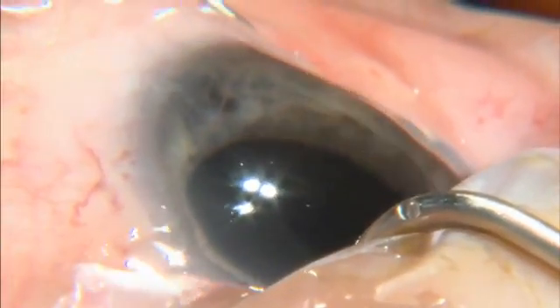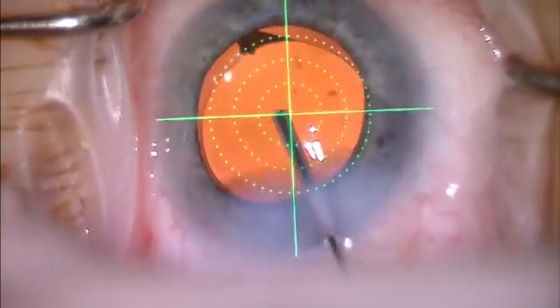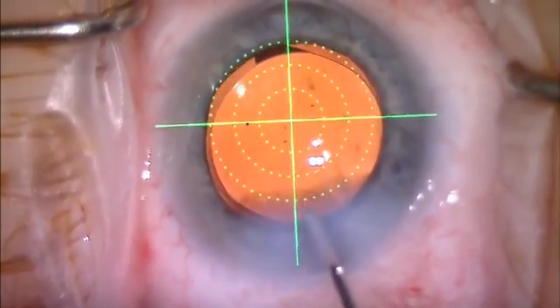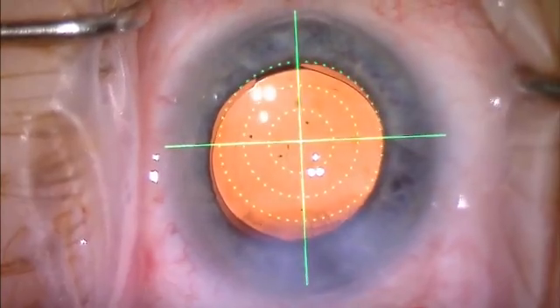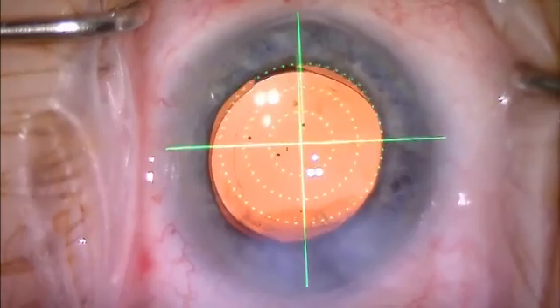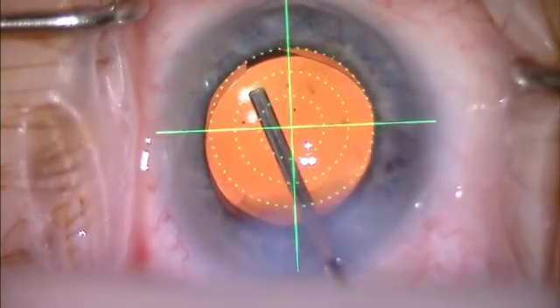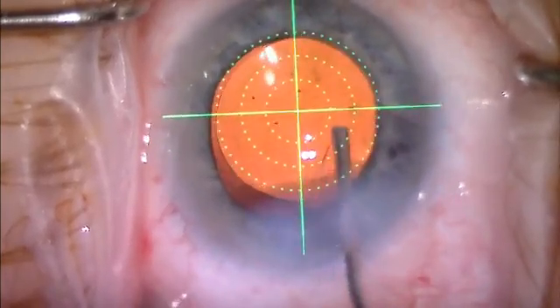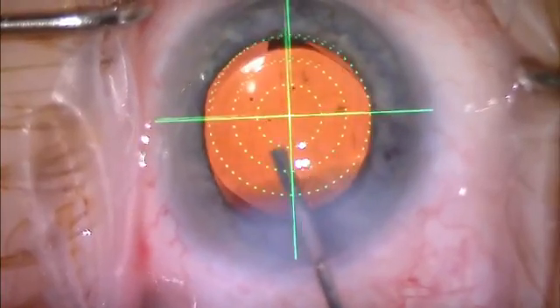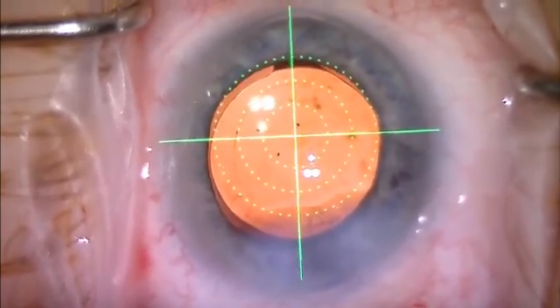That may mean that the foot plates may end up at 3 and 9, they may end up at 4 and 10, but wherever it is, we know it's going to stay there. For instance, right now, this lens has centered a little bit superior and temporal. So what I'm going to do is try to rotate this lens, and since with a block there's not much posterior pressure, I can rotate that lens very easily, not even using irrigation aspiration.